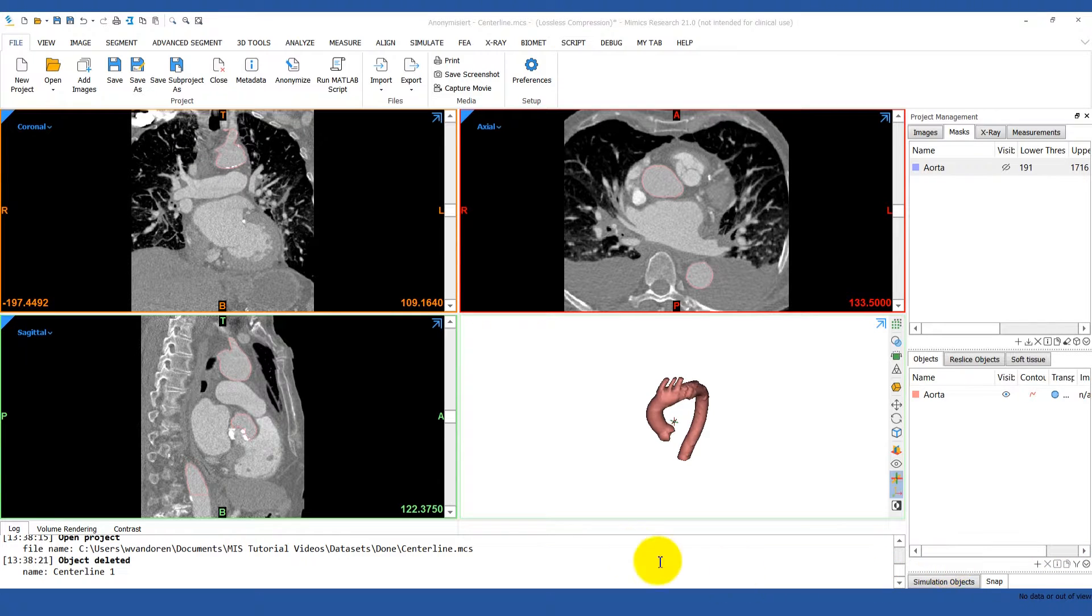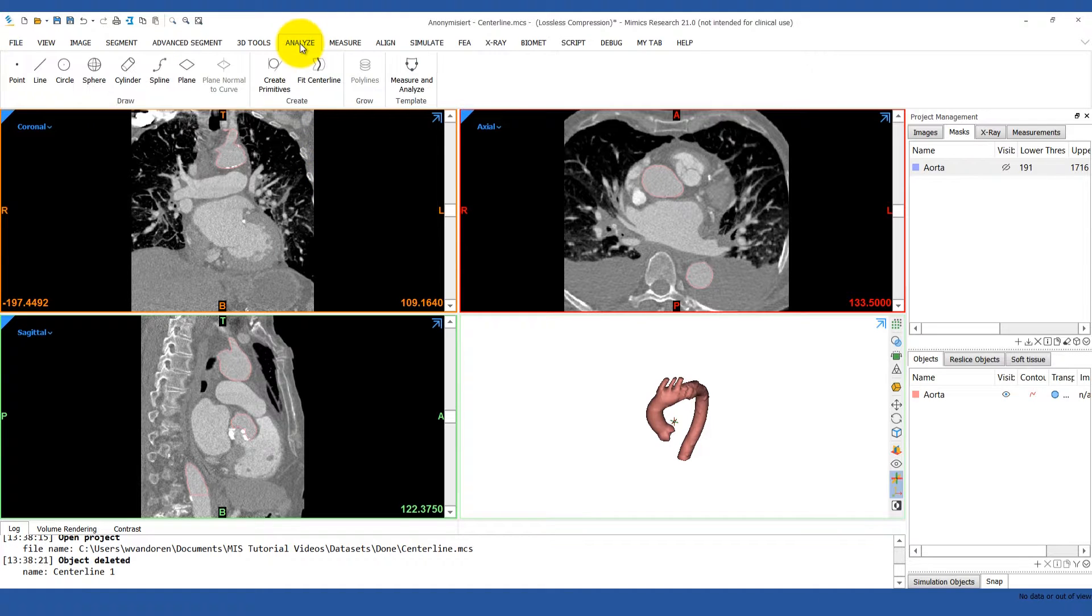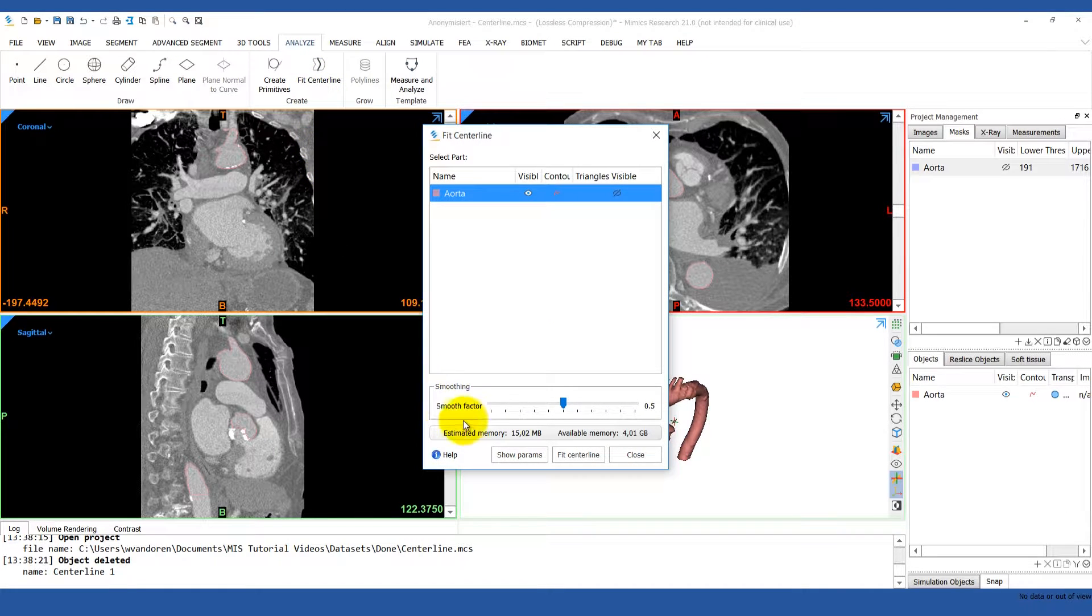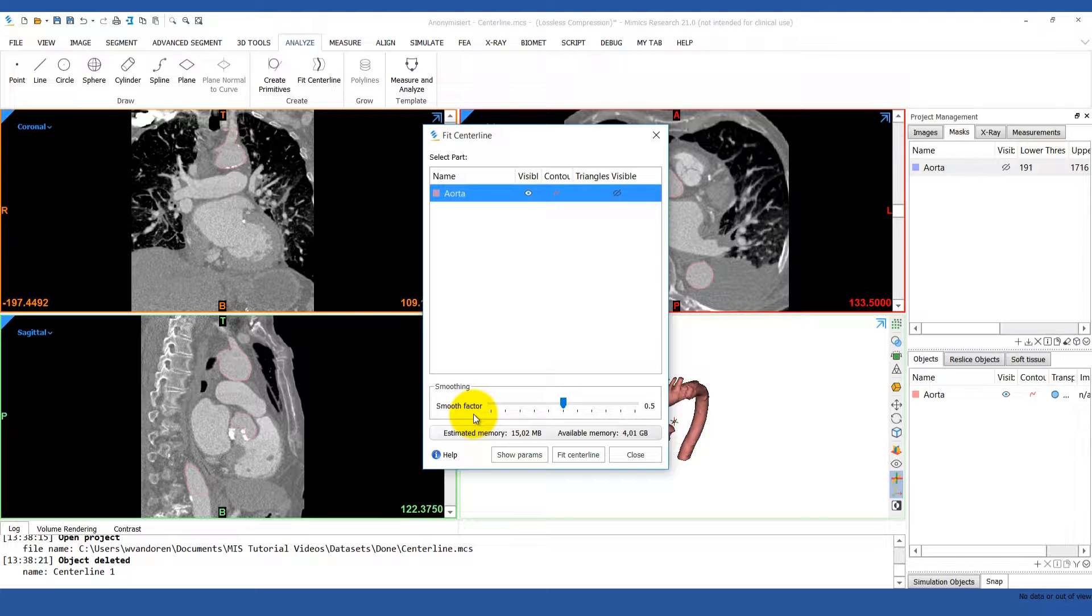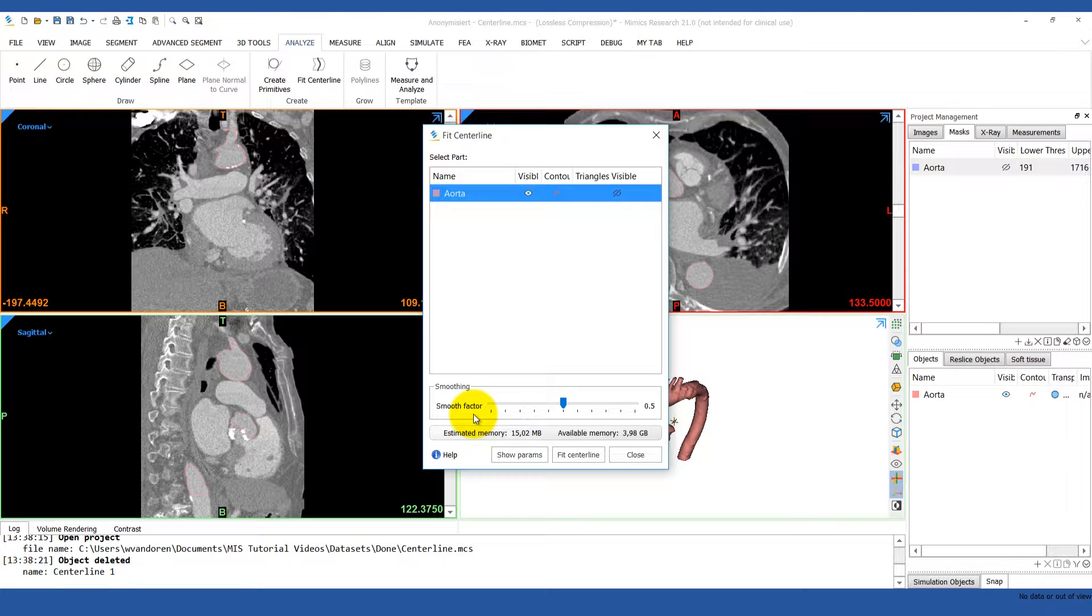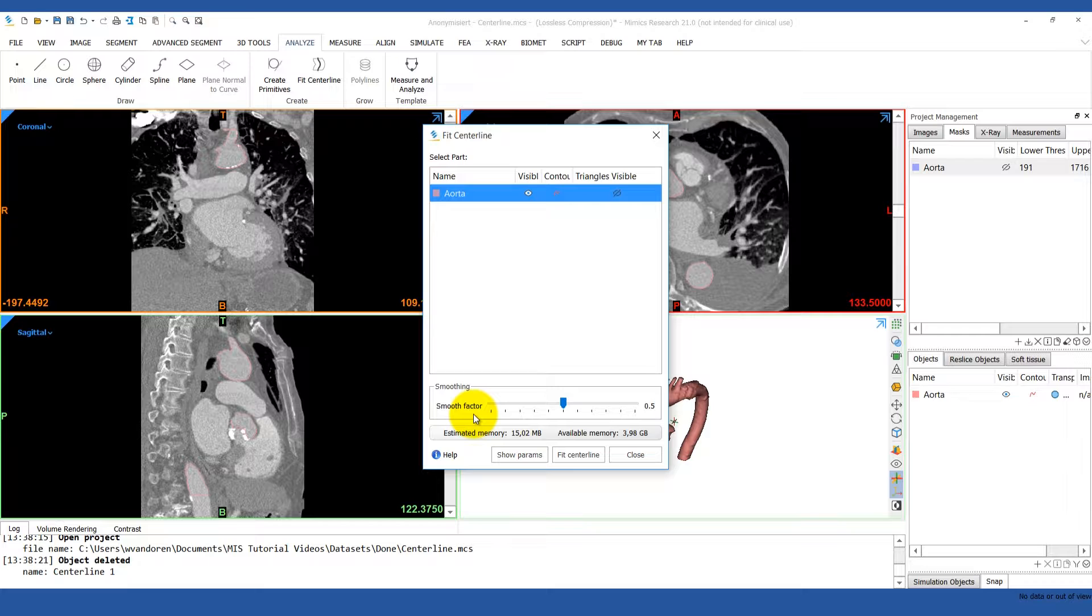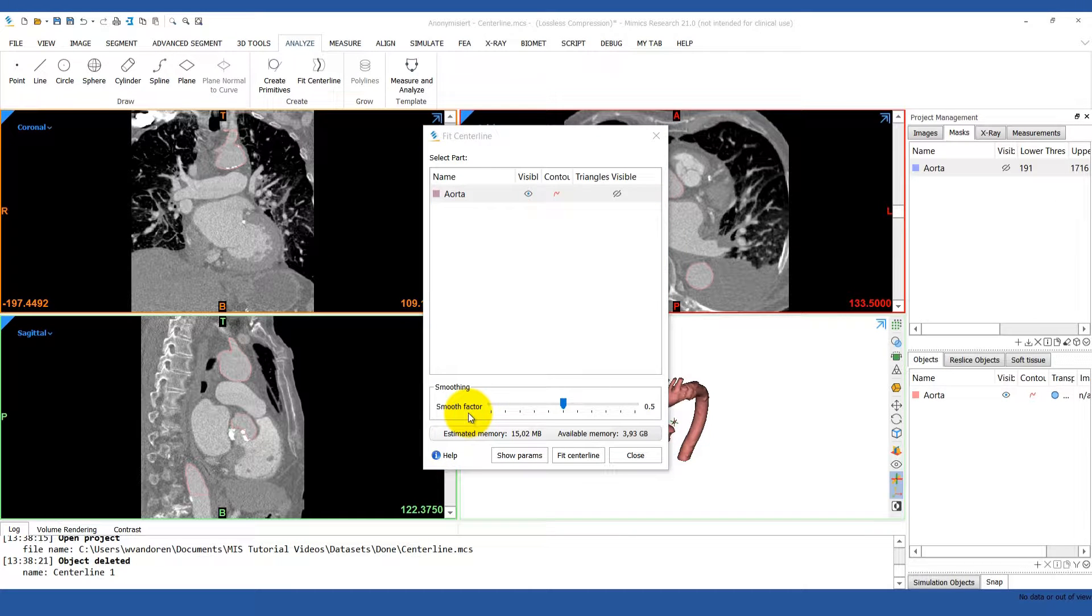To start, go to the Analyze tab and select the Fit Centerline tool. There are a few parameters you can adjust for this tool. The first is the Smooth factor, which controls the level of smoothing performance. Smoothing will stop when one point in the centerline branch deviates from its original position by a distance greater than the Smooth factor times the average branch radius. Just remember that a higher Smooth factor results in a smoother centerline. Most of the time, you'll keep it around 0.5. In extreme cases where there are very short turns in the geometry, you may want to choose a lower Smooth factor.